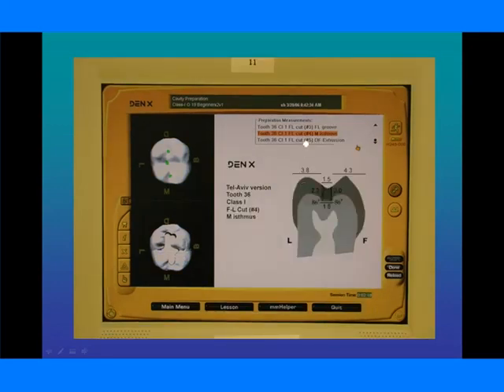Okay, our next cut, number 4, is through our mesial isthmus. There's that term again. You're going to see this quite often. This is our mesial isthmus here between our mesiobuccal and mesiolingual cusps. You'll notice that the floor is 1.8 millimeters wide, the occlusal is 1.5. Again, these walls converge. And you'll notice too that the depth is basically 2 millimeters.